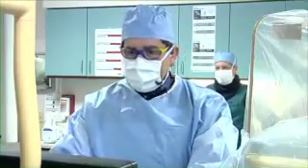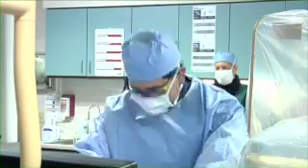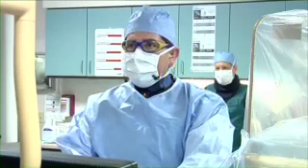Great answer. Where are you now? Do you have the delivery sheath in, or are you placing it in? I am placing it in. I have the wire across. Can you focus right now on my hands, please? We are advancing the sheath inside the femoral vein, and I'm going to show you, as Dr. Roberts showed you in a cartoon, how this happens. So this is the catheter, and it's going up to the heart.